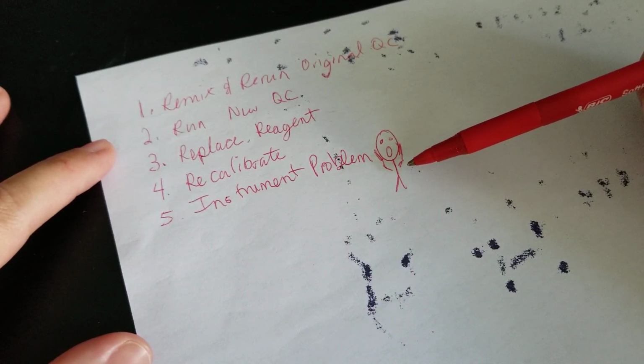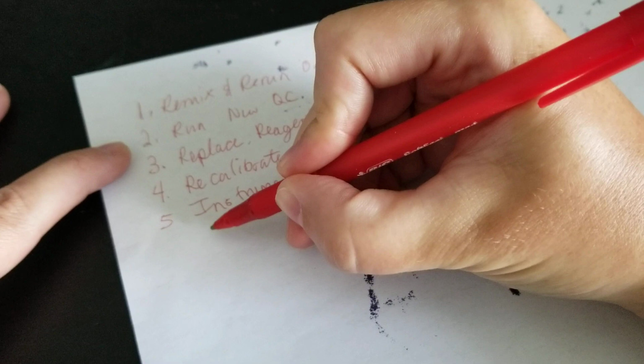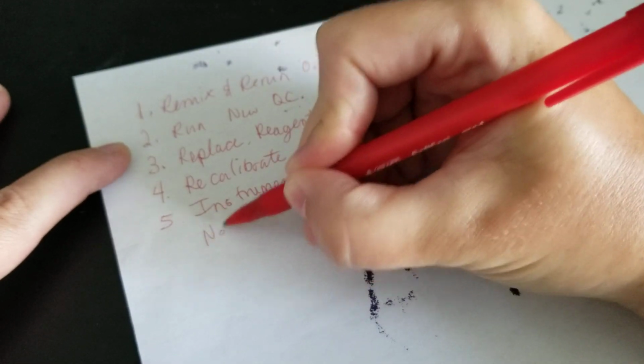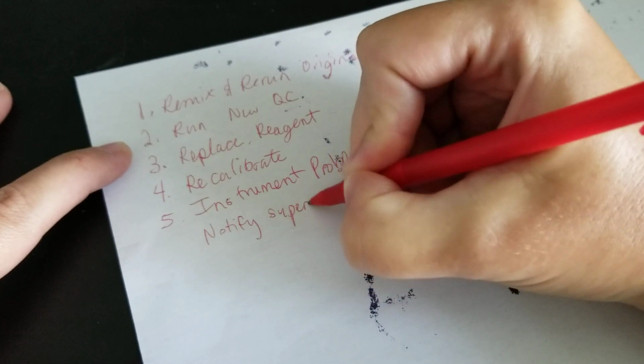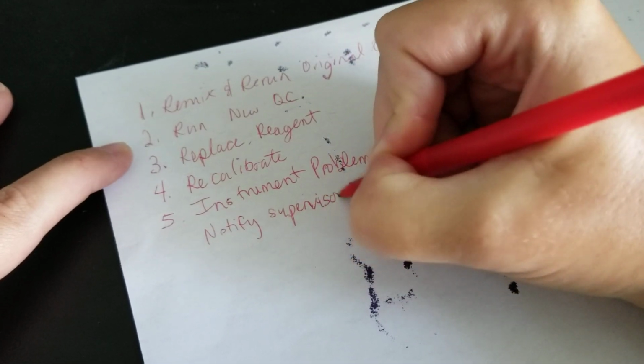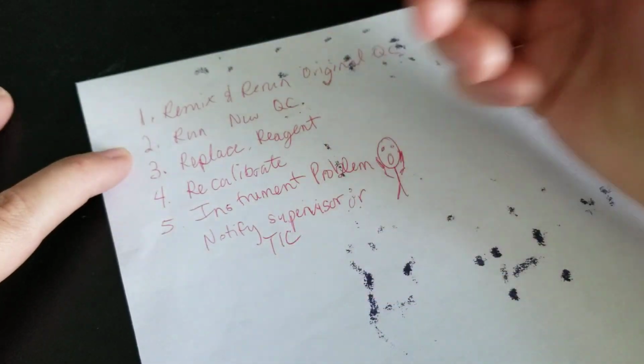If it's not something as simple as that, whether it is or it's not, you're going to need to notify the supervisor or the TIC, which is the tech in charge.